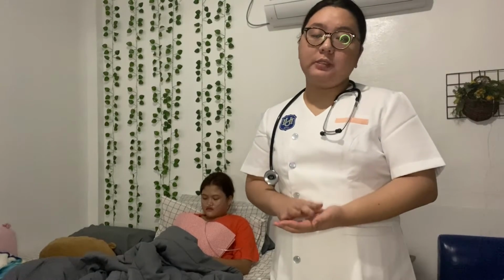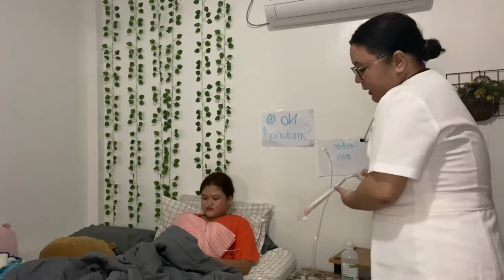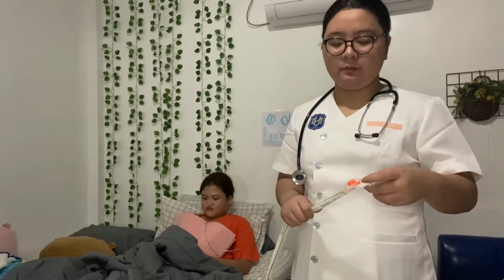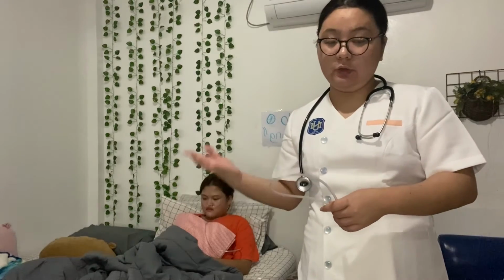If using a sterile suction kit, I need to open the suction catheter. And also take note, do not allow the suction catheter to touch any unsterile surface. So unwrap or open the sterile basin on the table and be careful not to touch inside the basin. Fill with about 100 ml sterile normal saline.